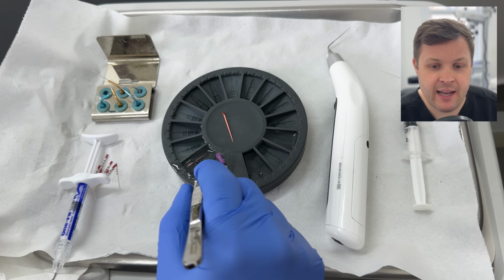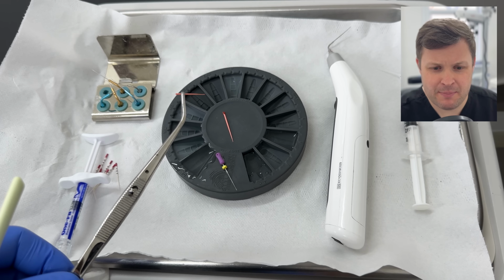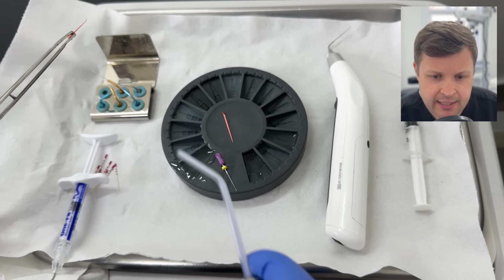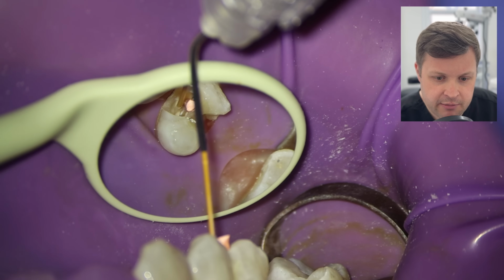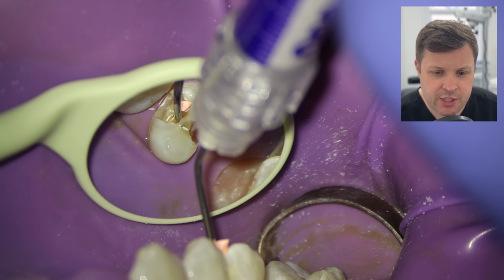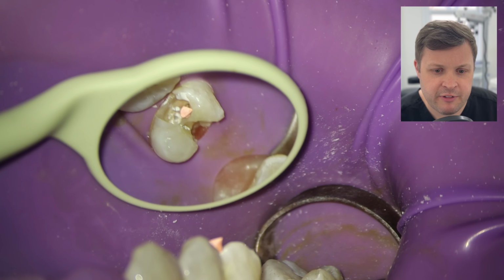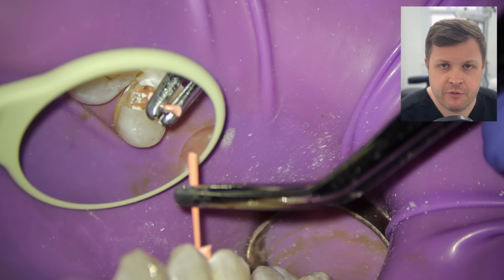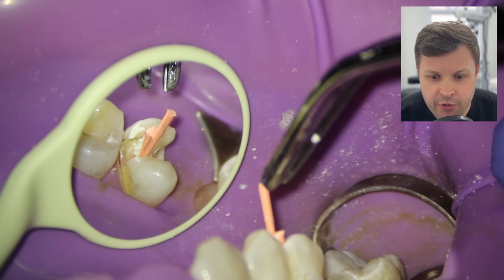Same again, dip it in isopropyl alcohol. We're going to blow off the excess. Sometimes this makes a bit of a mess. And then I think in this case, what I'm going to do is I'm just going to get my obturation. I'm just going to fill this tooth with lots and lots of sealer. I don't want any voids, so I'm not taking any chances. So I'm going to get our accessory cone. I'm going to fit this nicely to length, and hopefully we've used enough of the GP, enough of the sealer, and this is going to create a nice monoblock appearance on the radiograph.